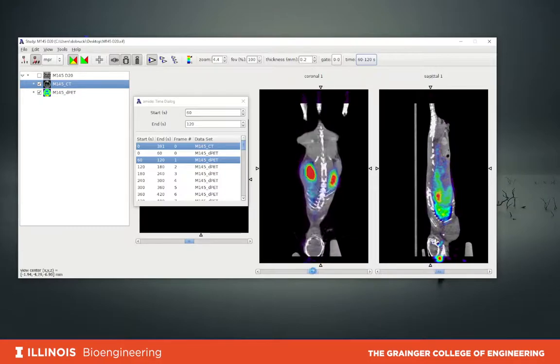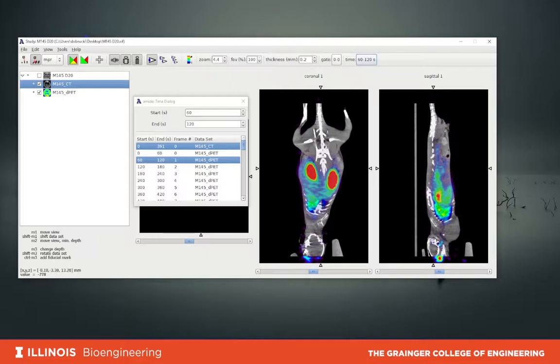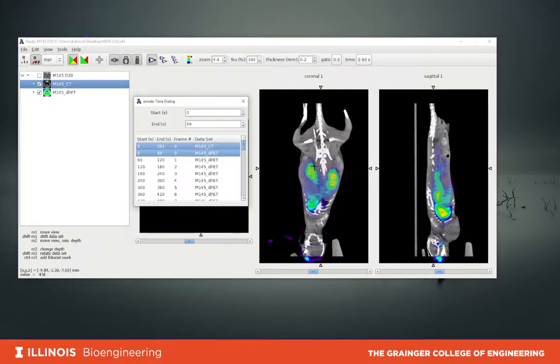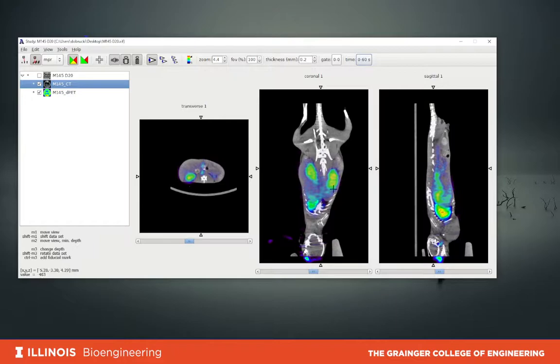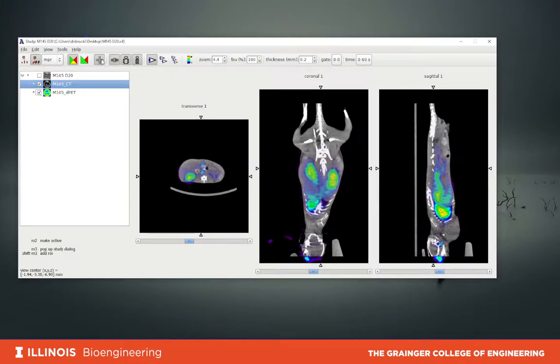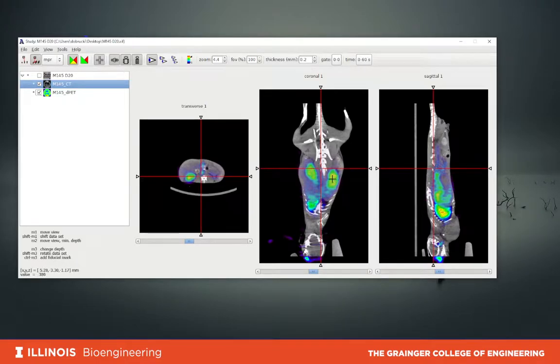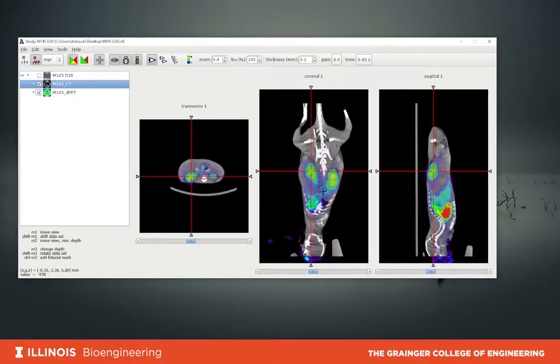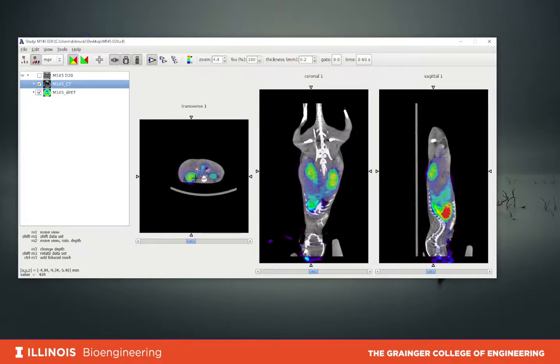I will not provide the solution to the homework, but I'd like to show you how to perform the analysis of what's going on in the kidneys. Let's start from time zero so we can see the kidneys. Right now we are looking at the first minute of the PET acquisition where we have nicely visualized kidneys. We can use this tool to point at the kidney — we are selecting the left kidney of the animal — and we can define a region of interest to encapsulate some of the kidney tissue.